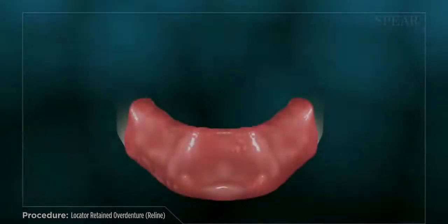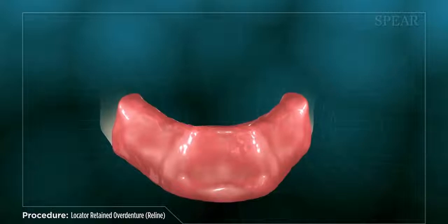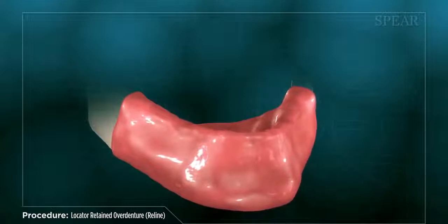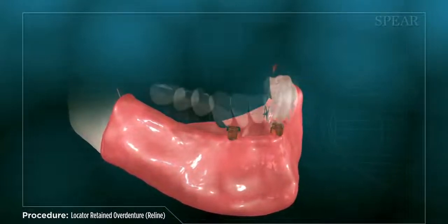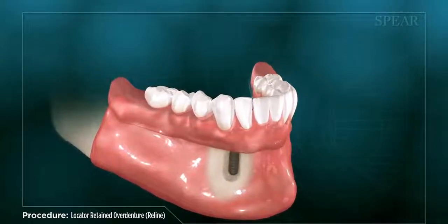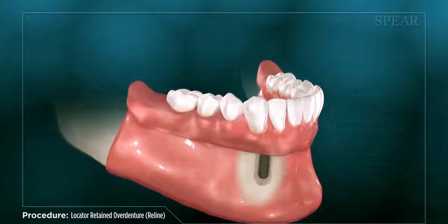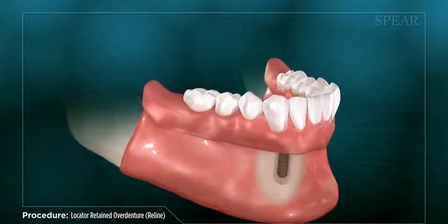For existing denture wearers seeking improved stability and function while eating and speaking, converting to a locator-retained overdenture with dental implants is an excellent treatment option. Converting to this type of prosthesis is a convenient and cost-effective way to obtain the stability provided by dental implants, combined with the convenience of a removable denture. It will require multiple appointments for your doctor to place the dental implants and complete the conversion of your existing denture.